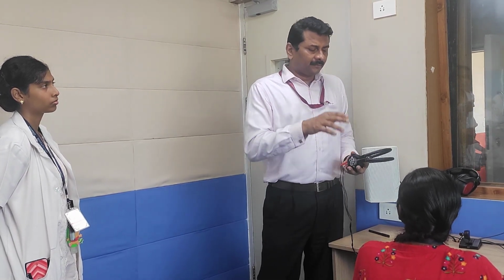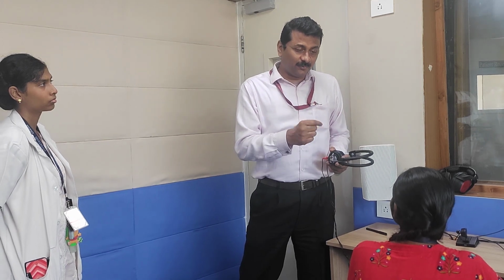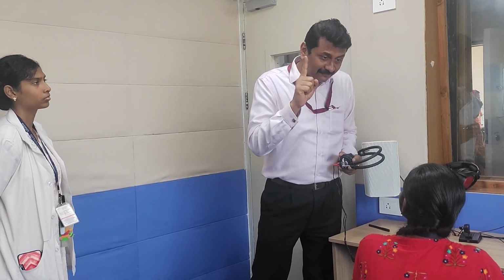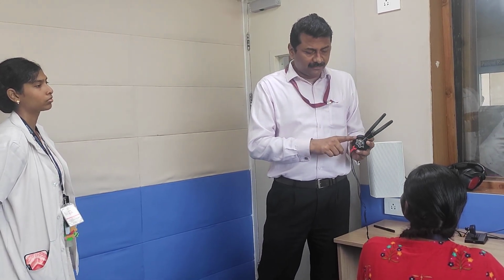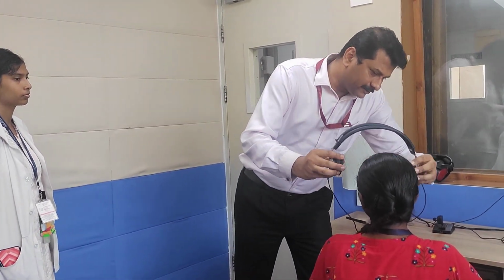Okay? But remember one thing. We are interested in knowing how minimal you hear. So, we are checking your threshold, the point where you hear 50% of the time. So, you have to raise your finger even if you think you are hearing. Correct? Yes. And then I'll be putting the headphones to your ears. Okay? And wherever you hear, you have to raise your fingers.